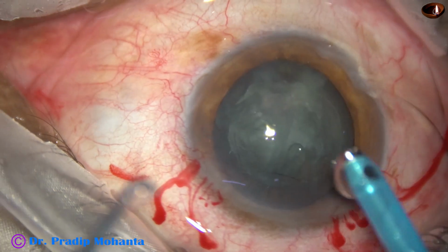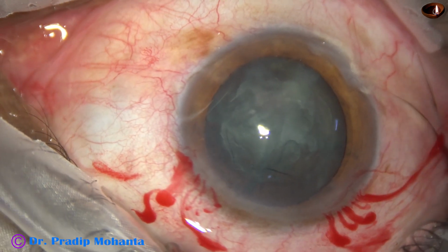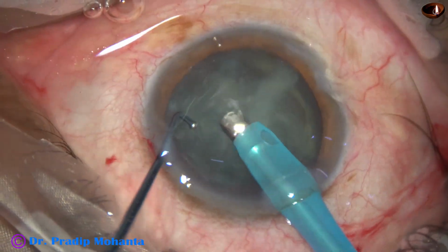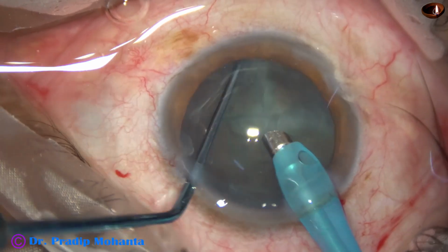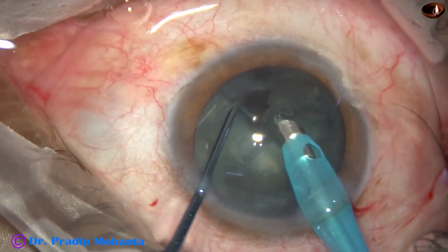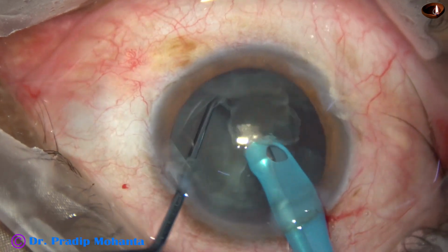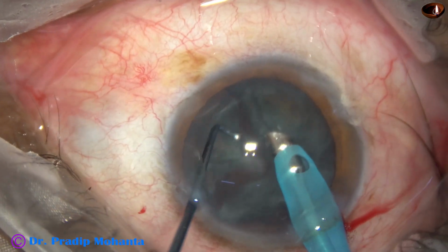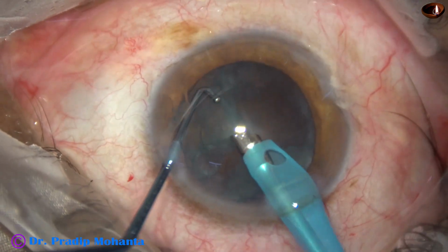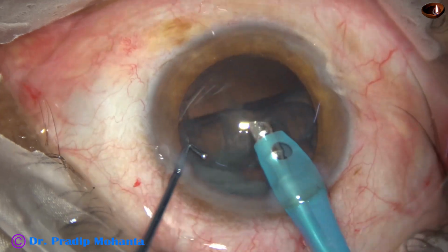After filling up the anterior chamber with visco, the handpiece goes into the anterior chamber. The phaco needle goes into the anterior chamber, and we try to find a gap between the pieces, and the pieces easily come to the center of the anterior chamber, and we can easily emulsify these nuclear pieces. And this is the last nuclear piece, and it comes so easily.